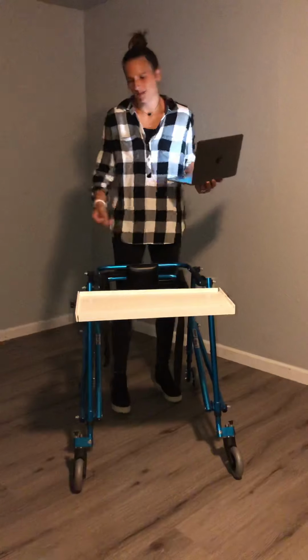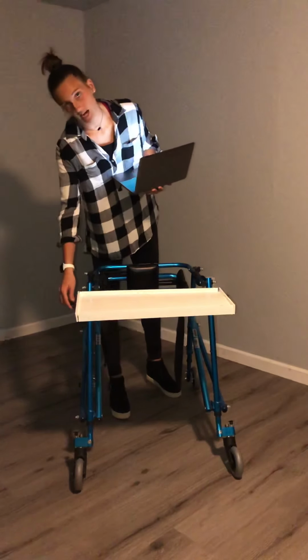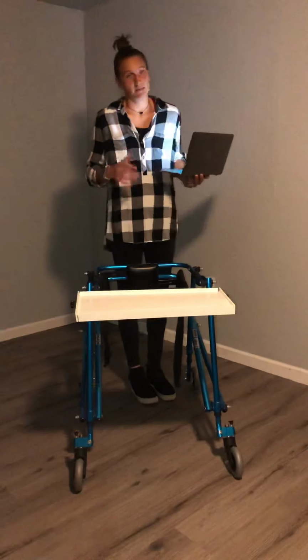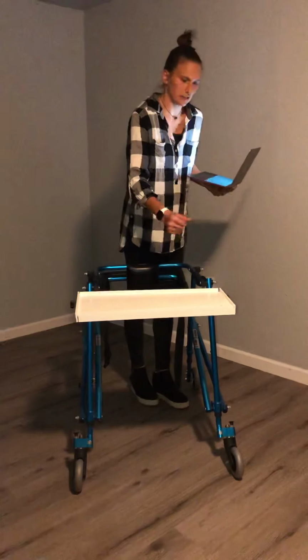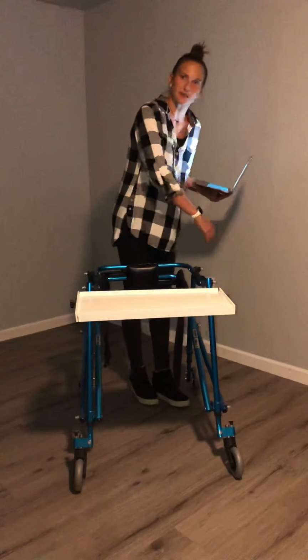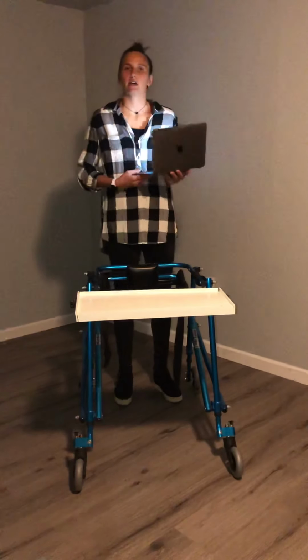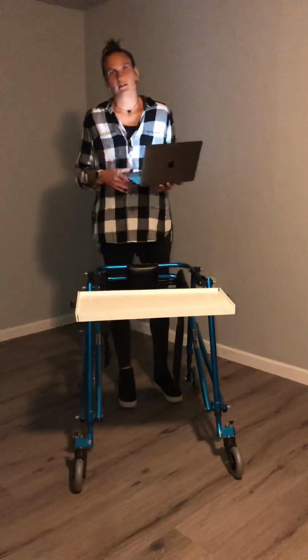And the one thing that I would do much differently: this tray is not permanent, it's temporary. It's temporary because every time you're done with it, you have to unscrew these black brackets and take it off. If it was a permanent thing, I would have created it so that you loosen it, and when you're done, you just swivel it to the side and push it down and it lays flat against your walker, whereas you have to take it off every time you're done with this temporary use. So I would definitely change that because it's got to be a hassle for someone to take it off every single time.